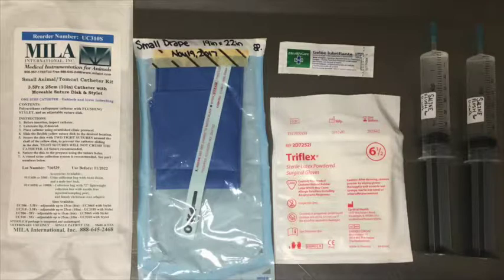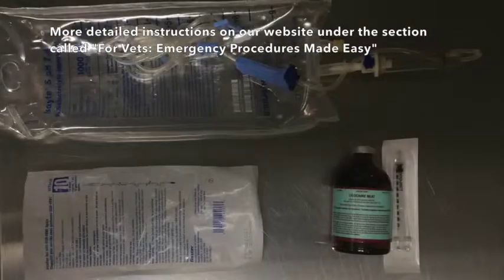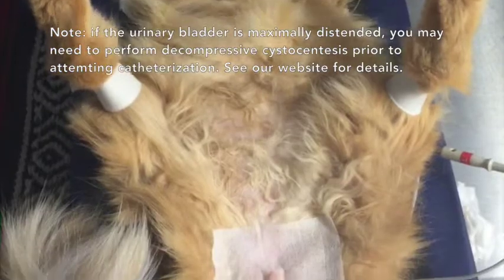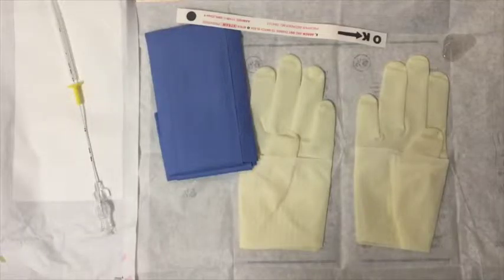Before you start, ensure that your patient has been adequately stabilized. Get all of your supplies out and ready to go. Pain relief and sedation should be titrated so that the patient can be comfortably positioned in dorsal recumbency. Clip and aseptically prepare the patient. I also prefer to drape the area.